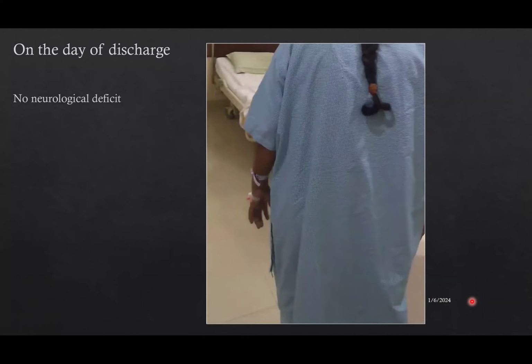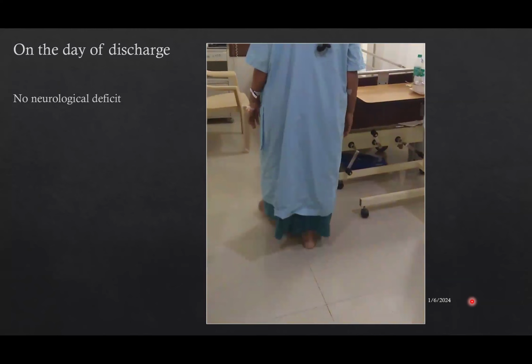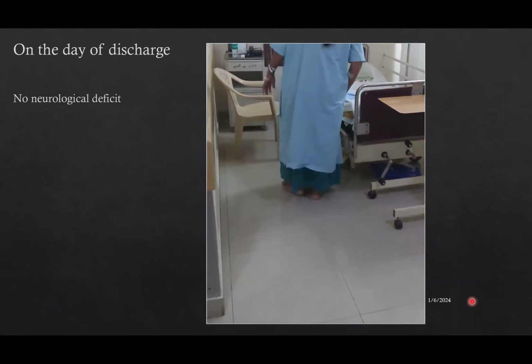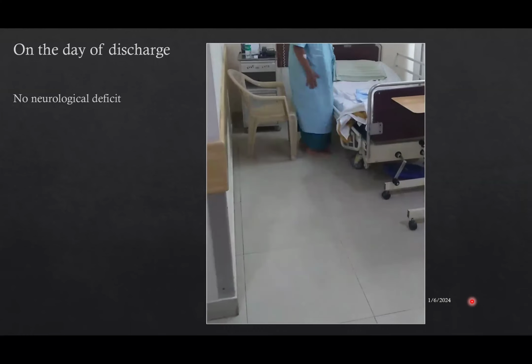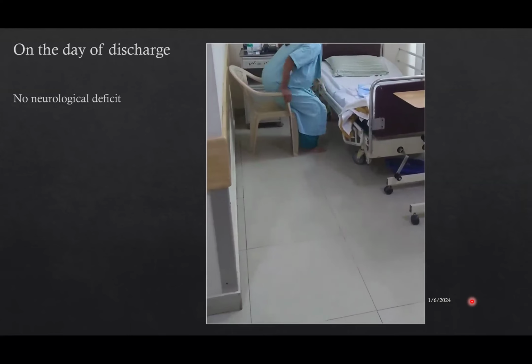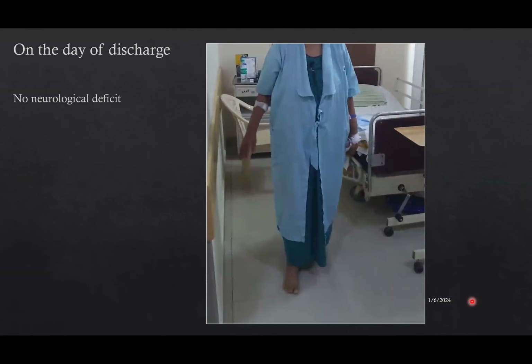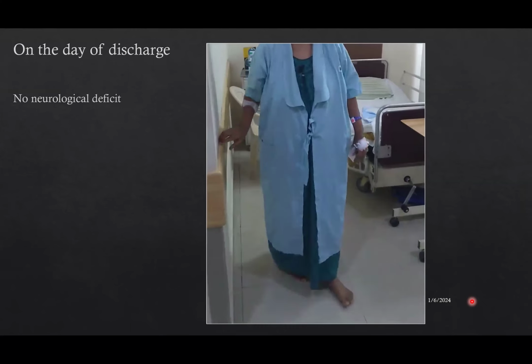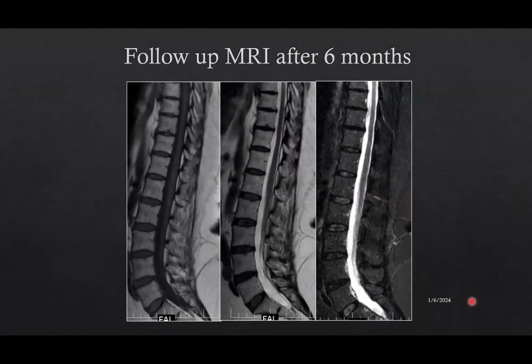So the only thing I want to highlight here is that if you're not able to navigate a catheter closer to the aneurysm, the other option is to block all the outlets through which the glue could get dissipated or go away, and then try to force the glue to the site of origin of this artery which you're intending to block. So this is a follow-up MRI showing complete resolution of the subarachnoid hemorrhage.